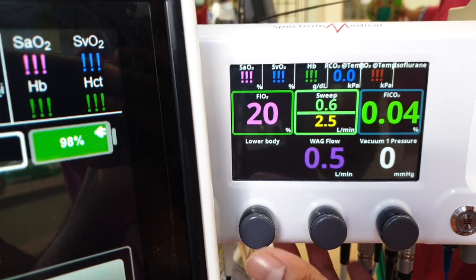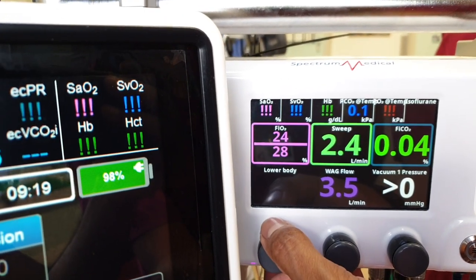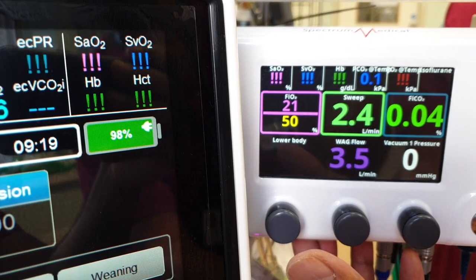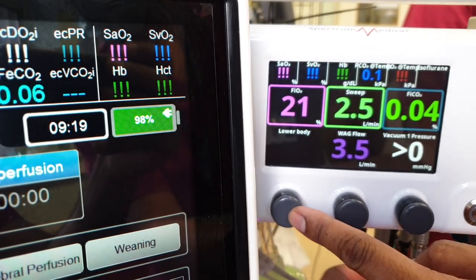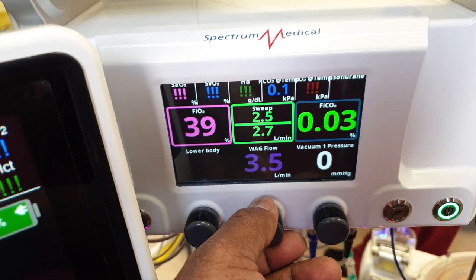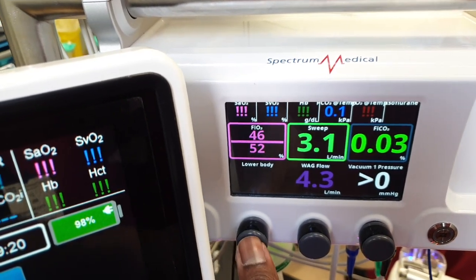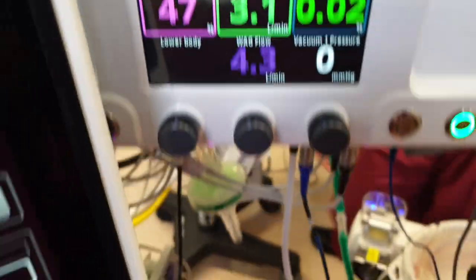And then with this FiO2, same. Turn it and then hit whatever settings you want and then push. Enter it. If you don't push it, it doesn't mean you entered it. That's it. And when you're happy, you can see the color changes. That's how you set it.